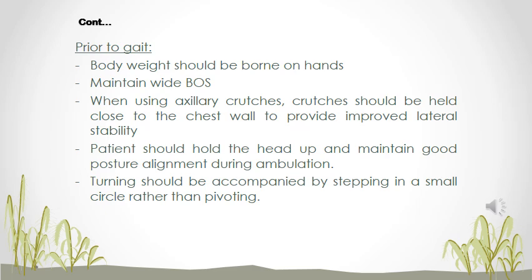This is very important because often, especially in total hip or knee replacements, we do not want any pivoting on that newly replaced joint. So it comes in handy if you can get into the habit of teaching your clients, your patients, to step in small circles, in a round circle, and not to pivot on the spot.